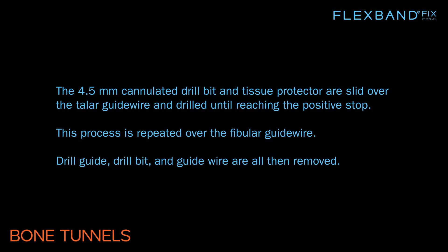The 4.5 mm cannulated drill bit and tissue protector are slid over the talar guide wire and drilled until reaching the positive stop. This process is repeated over the fibular guide wire. The drill guide, drill bit, and guide wire are all then removed.